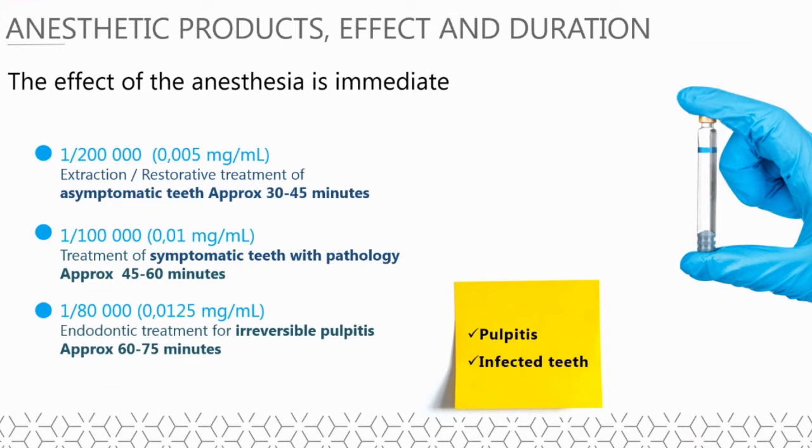An adrenaline concentration of 1 in 200,000 is ideal for the treatment of asymptomatic teeth and extractions of teeth with no periodontal problems. The duration of the anesthetic effect is normally from 30 to 45 minutes. An adrenaline concentration of 1 in 100,000 is recommended for the treatment of symptomatic teeth with pathology. The duration of the anesthetic effect will be normally from 45 minutes to 60 minutes.